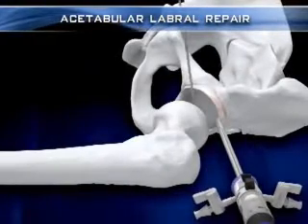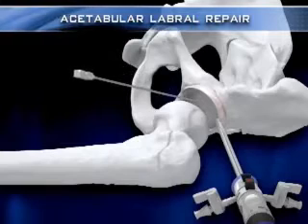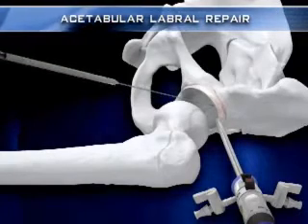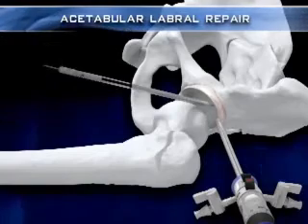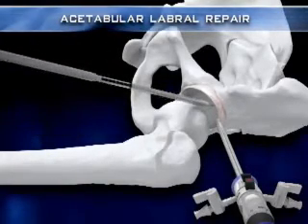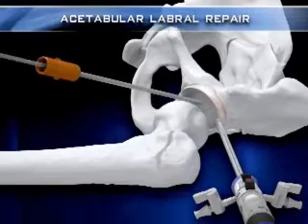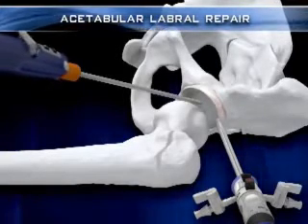The anterior portal is then established in an outside-in fashion under direct visualization using a spinal needle. The needle is replaced by a flexible nitinol guide wire so the 5 mm and 7 mm portal dilation sleeves can be used to dilate the hip capsule prior to shaver insertion. The shaver's outer sheath can be easily introduced into the joint over the guide wire by separating it from the inner sheath.